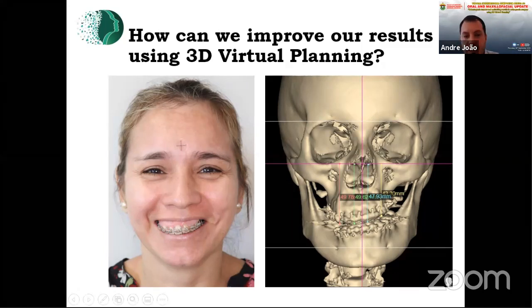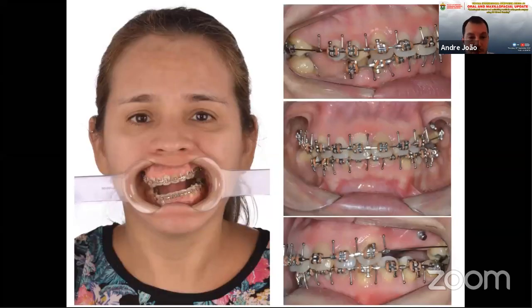Then I analyzed her models, and the occlusion was good and stable. Any kind of deformity here I can correct during the surgery. And I started my planning. That was the patient. You can see how asymmetric she was.